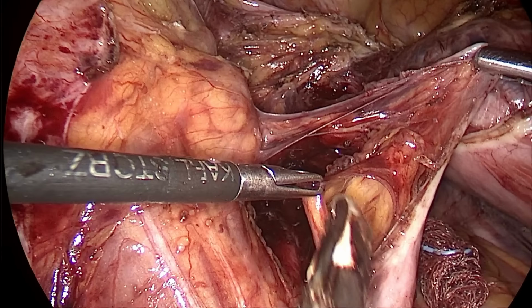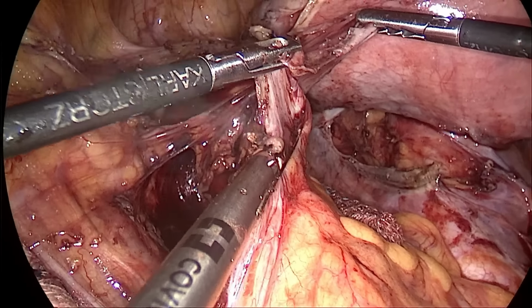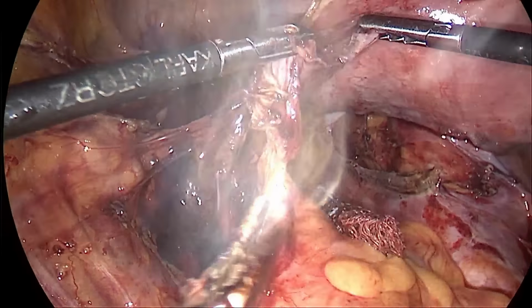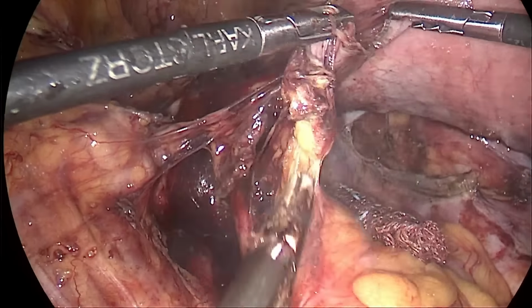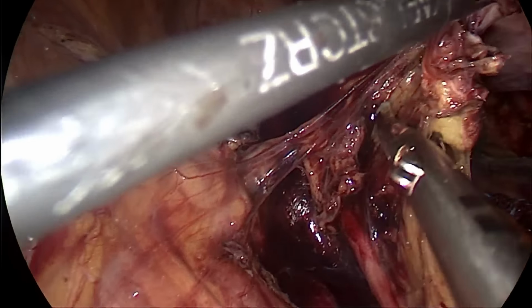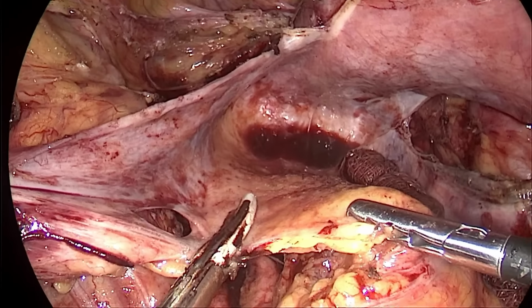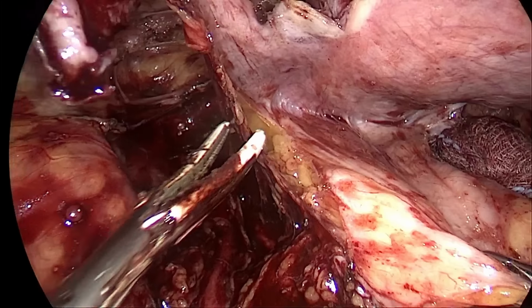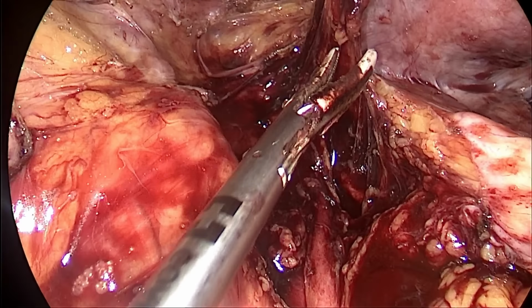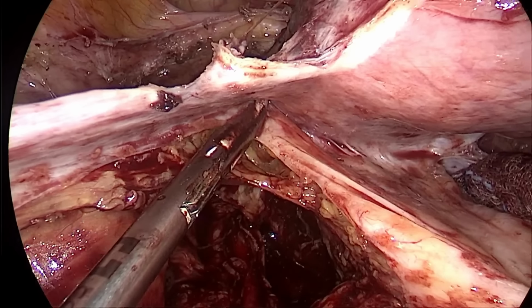So now, because we have to take the posterior part of the pelvic peritoneum, I am identifying the ureter again. So only the peritoneum has to be taken, so you have to keep track of the ureter and also the rectum. So the whole of this butterfly peritoneum has been included in the specimen.